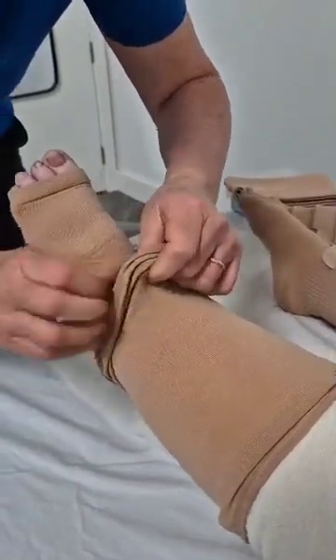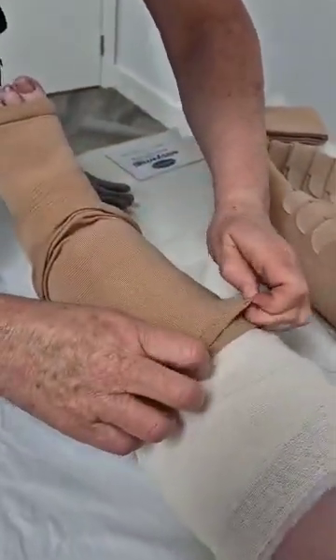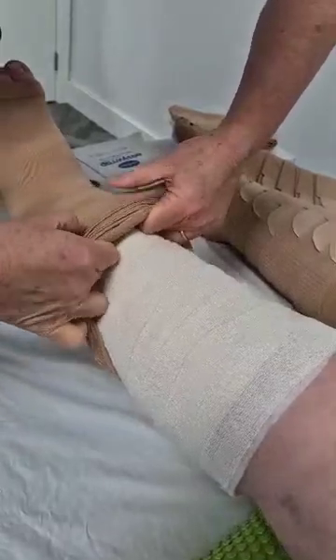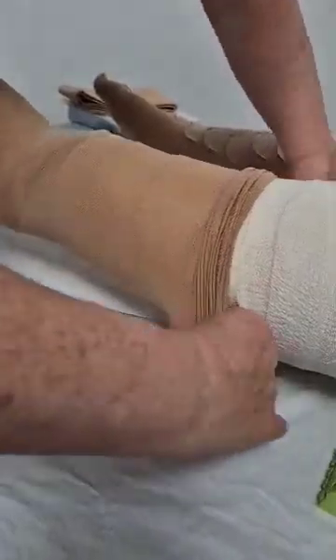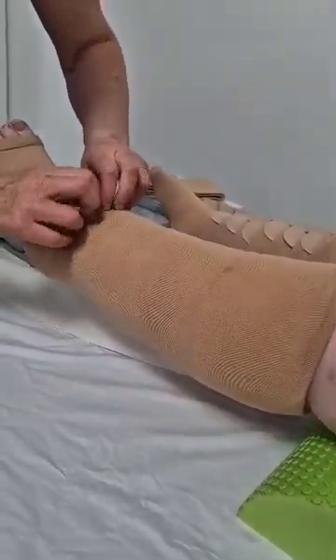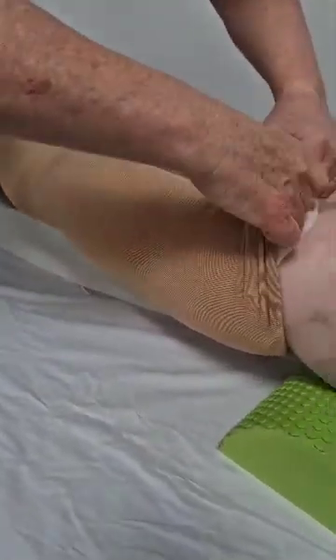But these are very similar to putting that tubey grip over the top of the crepe bandages. And then we're going to just sneak this up the leg. I think I've done all right there. Cool, how are we feeling? Fine. All right. Okay, so there we are. All right, so that's the first part. That's getting the liner on.